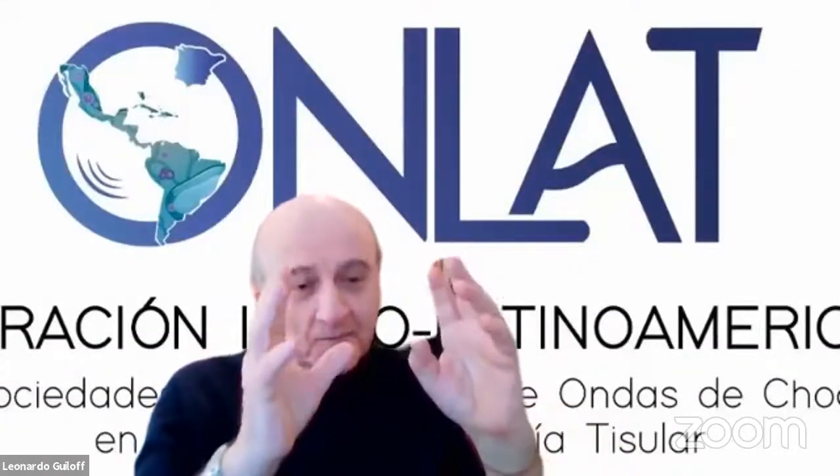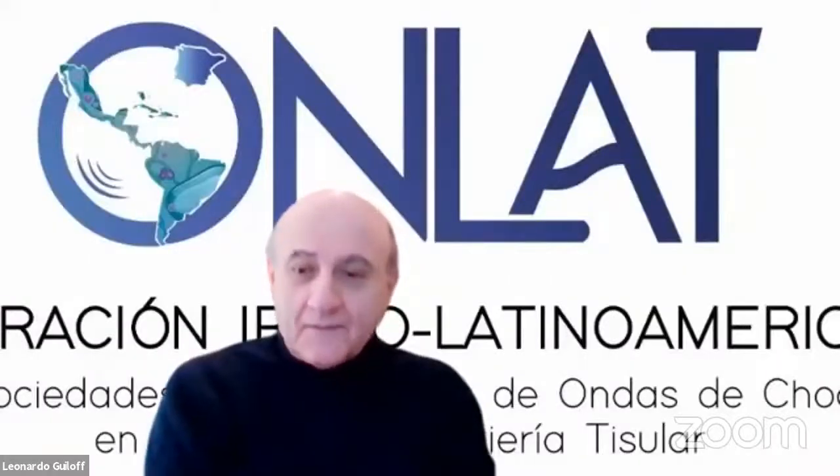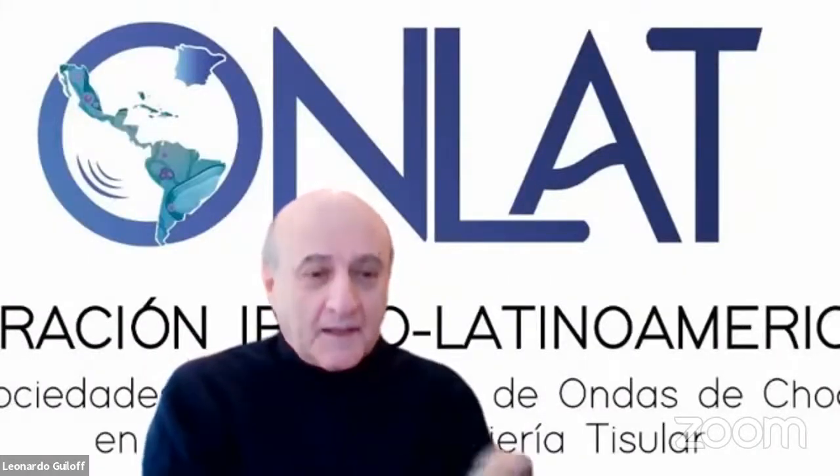Please, Christina. Shockwaves and rehabilitation. For me, shockwave and rehabilitation too. And Carsten, same thing. I did some 15-20 studies on eccentric training on Achilles. So eccentrics and shockwaves, and then EMTT is coming, and then low-level laser, because you need 5 low-level laser sessions for 1 shockwave session in efficacy.